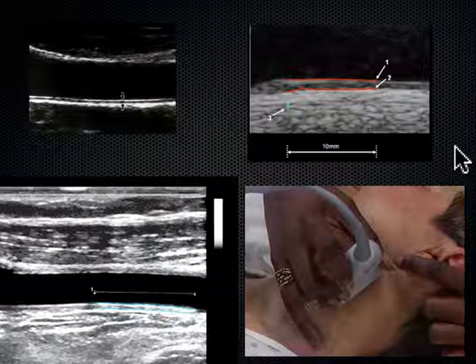CIMT. Any questions before we change gears one final time? Just something to introduce you to. And when we look today on the models, it's just a linear echo. You can't even see a separation because everybody's so young and healthy, okay? But when you take this machine out to preceptorships or clinics, wards, on older patients, you will start to see these thicknesses come off the screen.